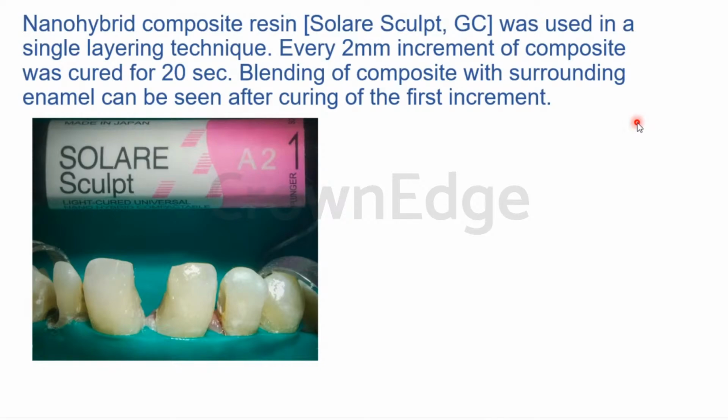And that is the reason why I have placed a rubber dam. And even this small papilla which is protruding out is kind of bothering me right now. This was done about 3 years ago. So I am still kind of upset that I didn't have some liquid dam or gingival protection barrier that I could have placed on these papilla areas, that would have given me optimum moisture control. Okay, either way, it's a decent moisture control that we have obtained.